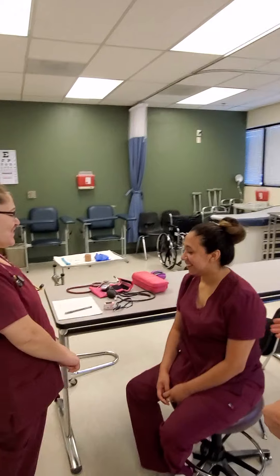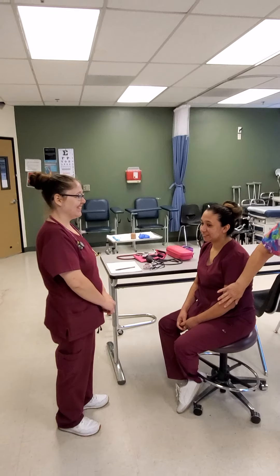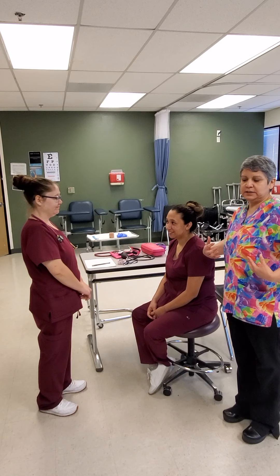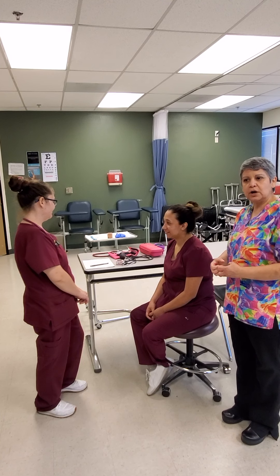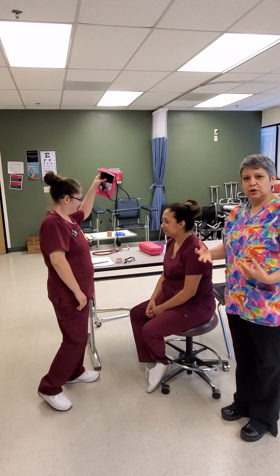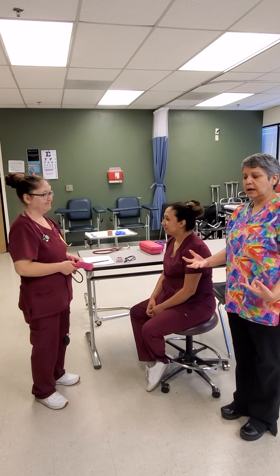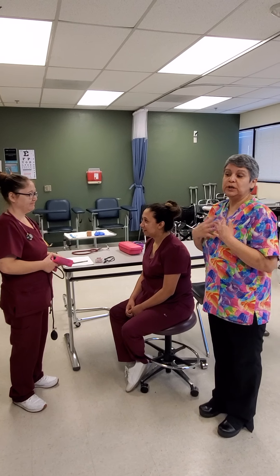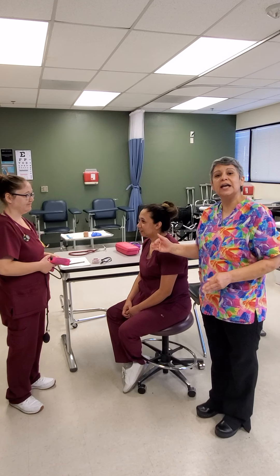Angela is going to start with the blood pressure. We are going to do blood pressure on the left arm. I like to use the left arm because this is where the heart is contracting the hardest, pushing out all the blood to the rest of the body. So we get a good pulse site from there. That's why I typically use the left side. We can use the right side for verification.